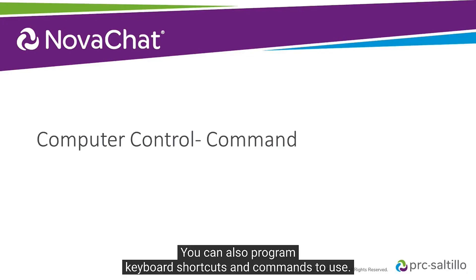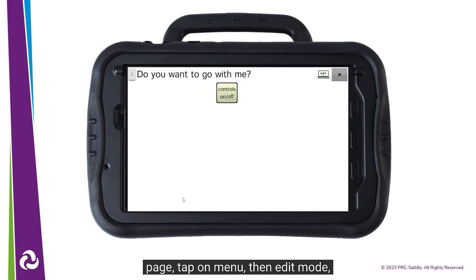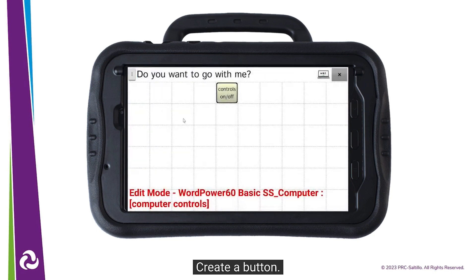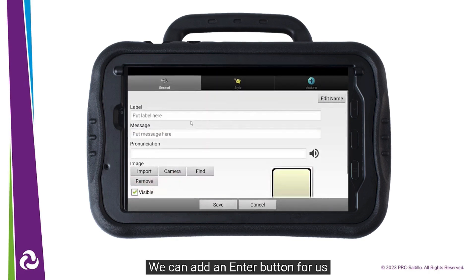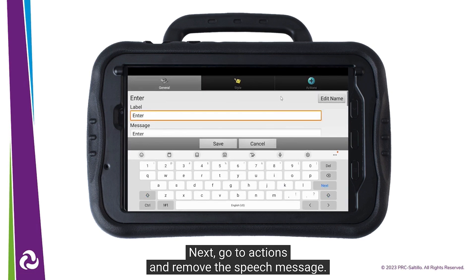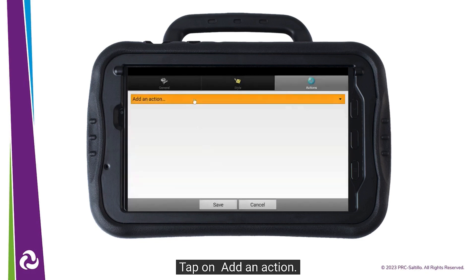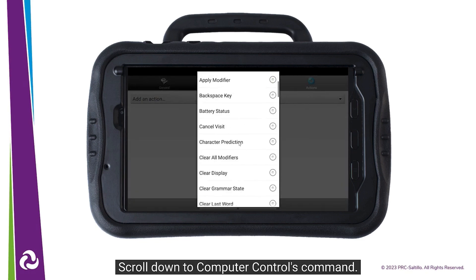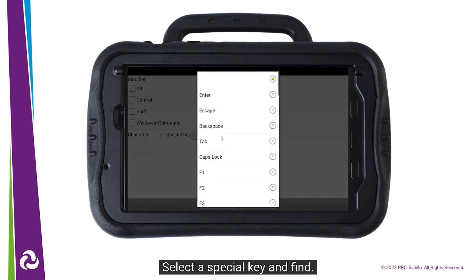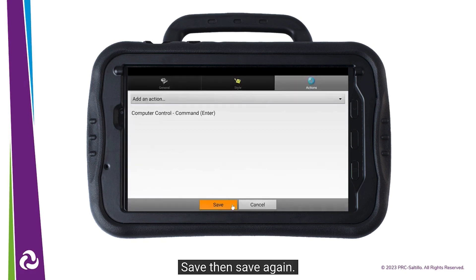You can also program keyboard shortcuts and commands to use. Go to your Computer Controls page. Tap on Menu, then Edit Mode. Choose a blank button, then select Create a Button. We can add an Enter button for us to use while typing, so we will give it that label. Next, go to Actions and remove the speech message. Tap on Add an Action. Scroll down to Computer Controls Command. Enter is a special key — select Special Key and find Enter in the list. Tap on Save, then Save again.